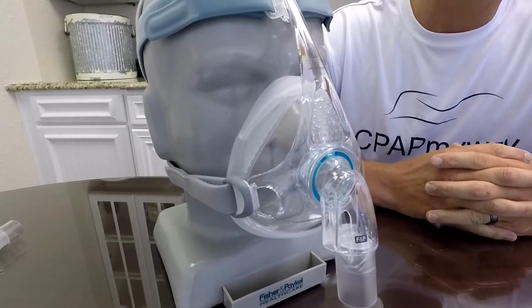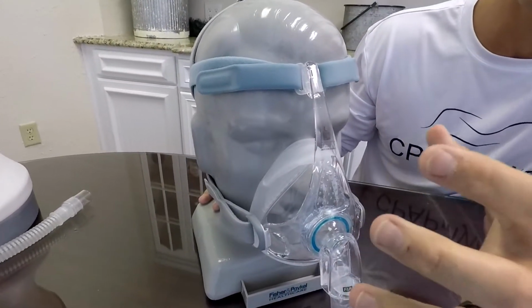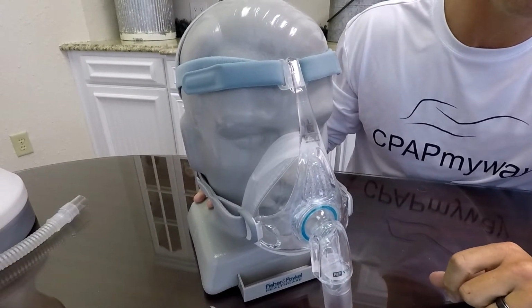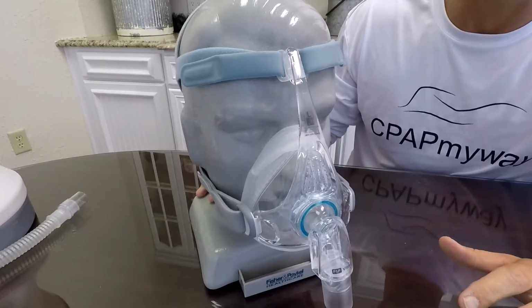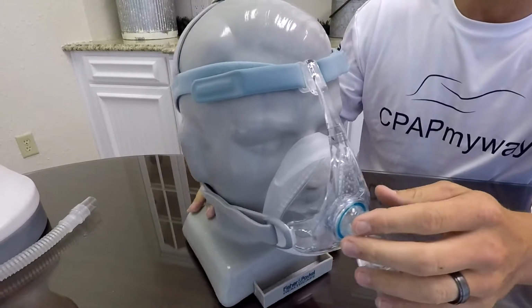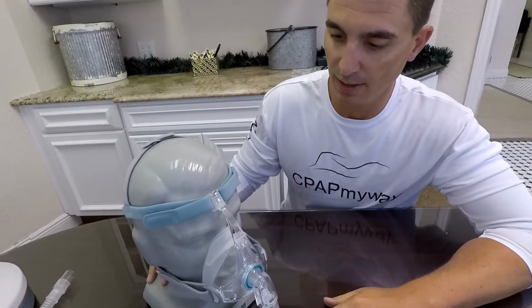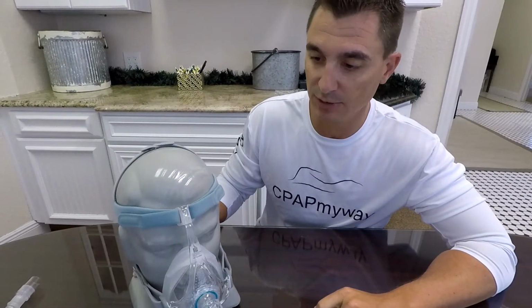The only thing we get complaint-wise is obviously it's a lot on the face, so people will get a little bit of a claustrophobic feeling sometimes with something over their mouth and nose. And it's a little bit difficult if you're a person that moves a lot side to side or likes to bury their face in the pillow. It's definitely a tough mask style because it usually has a pretty good amount of gear on the front of the face. But overall, a great option and works for a ton of people.